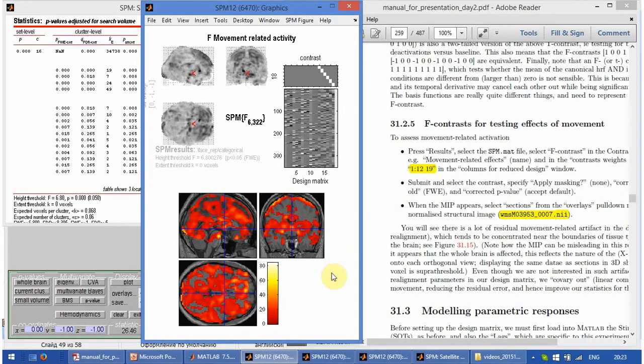You might say that the motion shouldn't produce a lot of problems, since we corrected for the displacements during the realignment step. It is partially true, but imagine that the displacement have happened just in the middle of the scan. This will change not only the orientation of the image, but also the shape of the image. Some slices can be acquired 2 times, and the brain will be stretched in the vertical direction. And this, unfortunately, cannot be corrected.